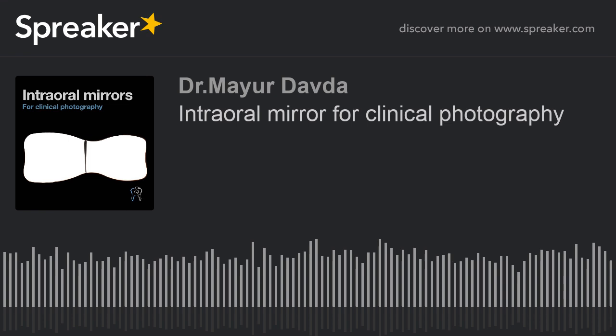There is one particular mirror that I absolutely love, and that is the Quadrant mirror by the Magic Box, that's by the Dental Photography School. The beauty of this mirror is that most of the people do not understand that the dentists document quadrants most of the time. So most of the mirrors are very broad. But the Quadrant mirror or the sectional mirror by Magic Box is a very slender and a long mirror. That is because it's very easy for the patient to accept these slender mirrors inside their mouth as compared to the full arch occlusal mirrors.